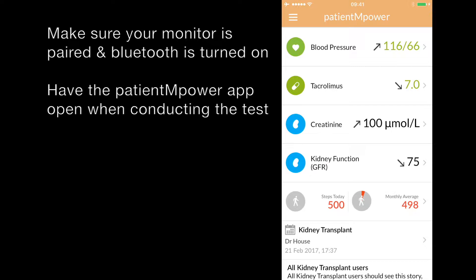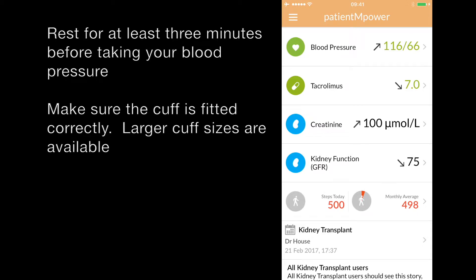When taking a blood pressure reading with your Patient Empowered Blood Pressure Monitor, make sure you first pair the device, rest for a few minutes before taking a reading, and make sure you fit the cuff correctly.